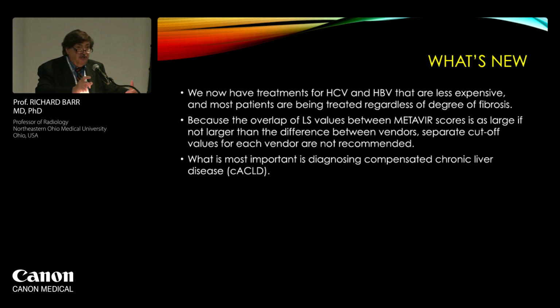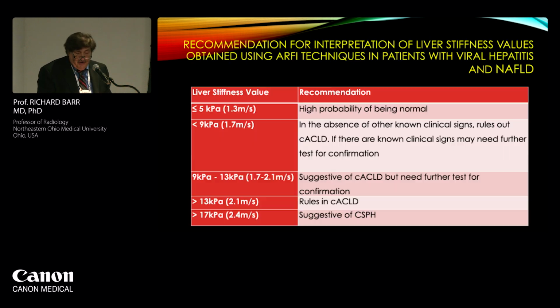And this is true also for pediatric patients that may have Fontan surgery, because again, their values are a combination of congestion and fibrosis. So what we want you to do is do a value as a baseline when their cardiac function is tuned up as best as possible. That's their number. And then you can tell if they're getting worse or better based on the change over time.